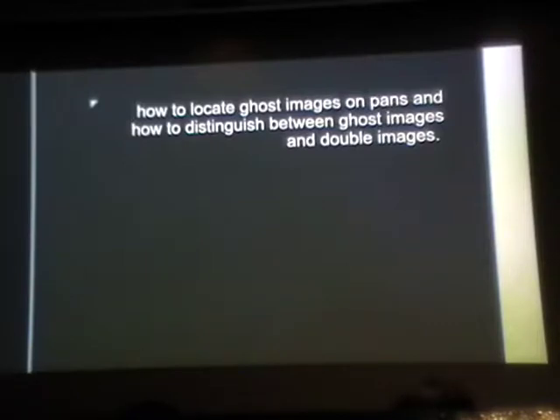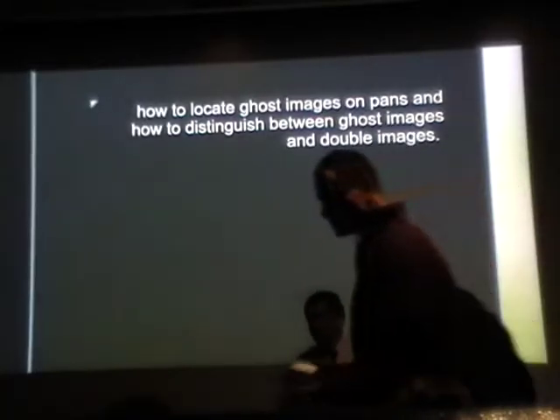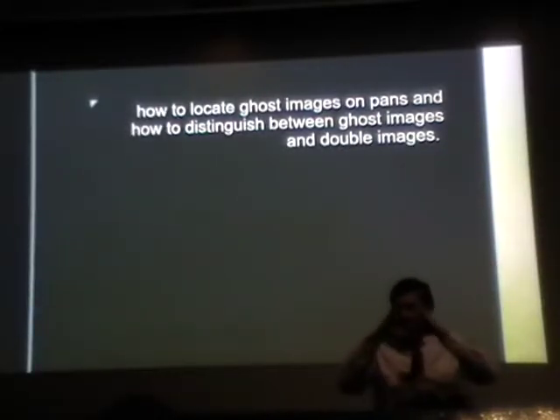Can you, I know you're eating. Can you talk a little louder, please? When objects are located in the midline, they can appear both on the left and right side of the image. Okay. How do you differentiate ghost images from the double images? Those images appear superior on the opposite side, and I believe the ghost image is larger. Okay. Horizontally, they will be magnified.